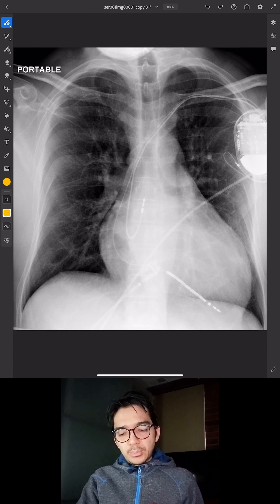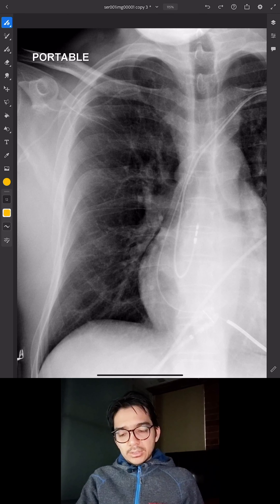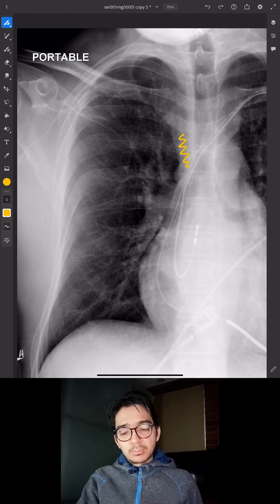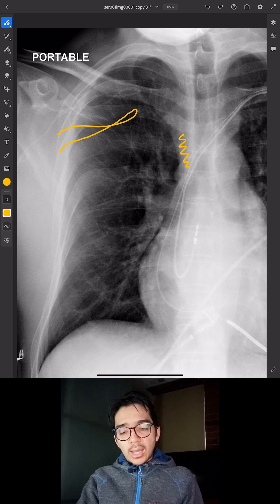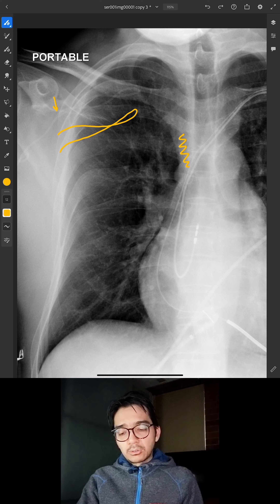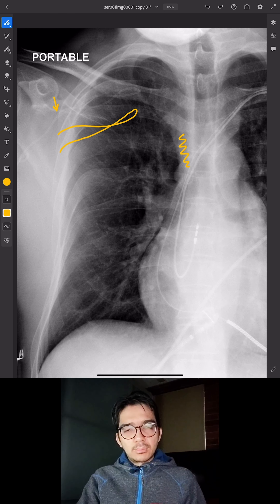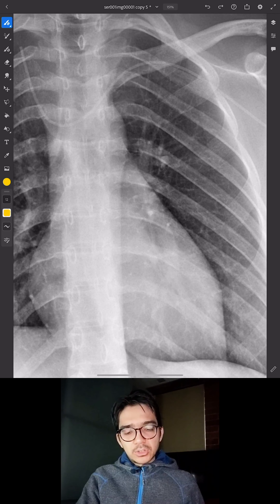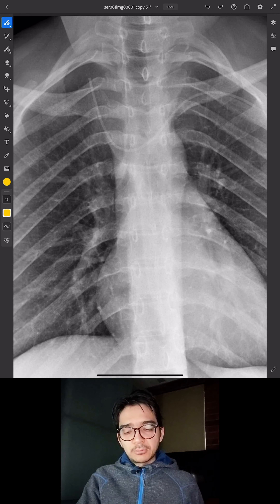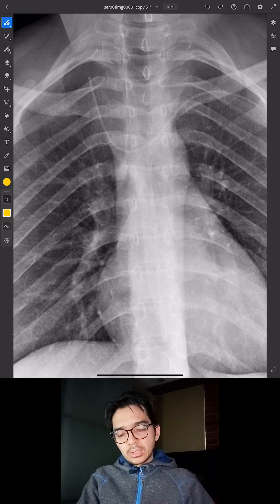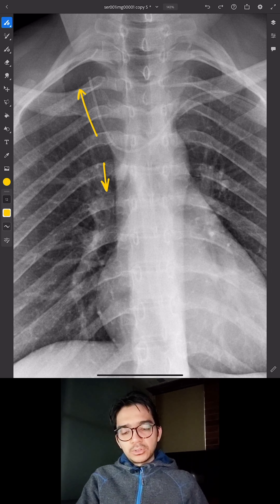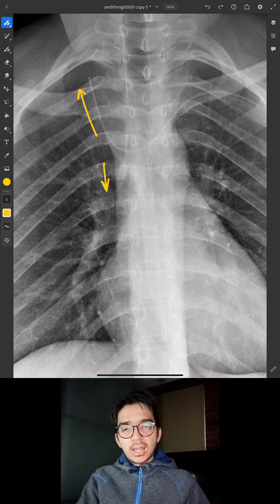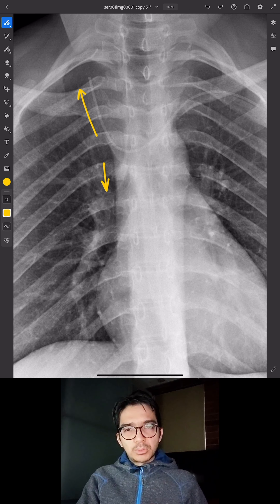Here's another commonly malpositioned line: sometimes PICCs get caught up and coiled in the subclavian region rather than going into the mediastinum — this one is coiled in the right subclavian region and needs to be repositioned. Another common malposition: a left-sided PICC that, rather than going caudally in the SVC, goes up into the right brachiocephalic vein and right internal jugular vein — it also needs to be repositioned.